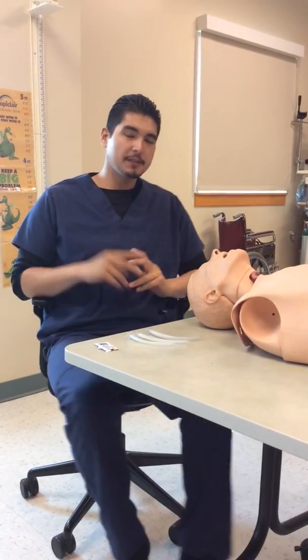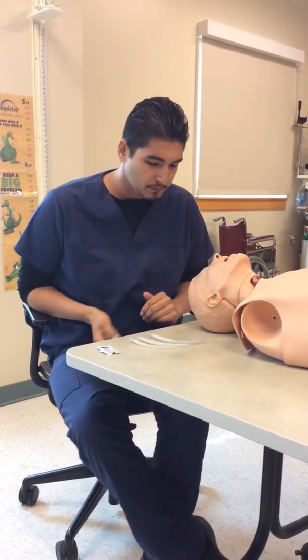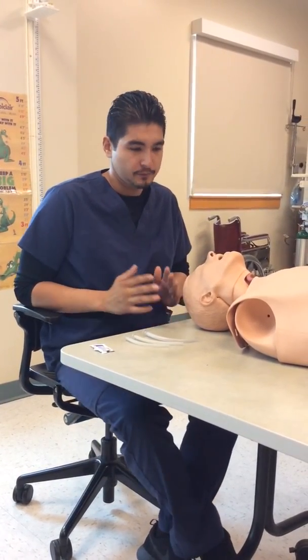Hi, my name is Joel Chavez, and I'm going to be showing you how to insert an NPA. So NPA stands for nasopharyngeal airway.